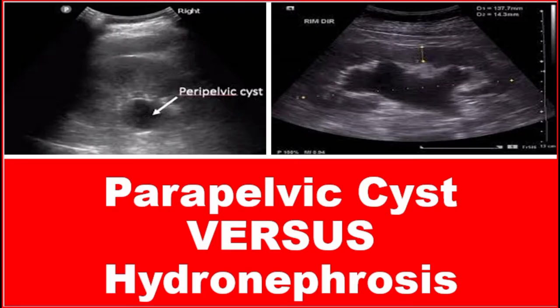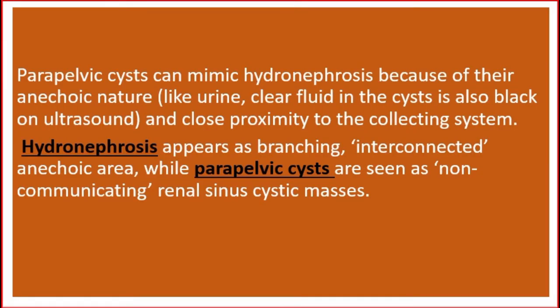Today our video is about parapelvic cyst versus hydronephrosis. Parapelvic cysts can mimic hydronephrosis because of their anechoic nature. Like urine, clear fluid in the cyst is also black on ultrasound, and it is in close proximity to the collecting system.